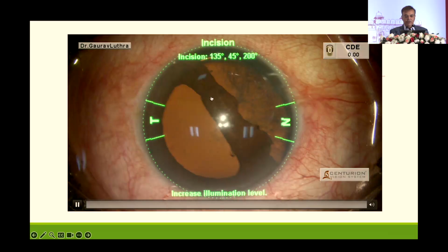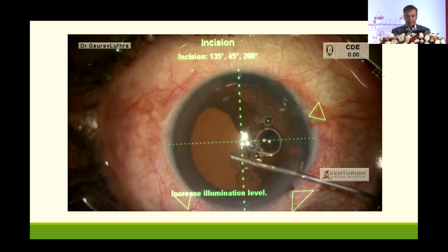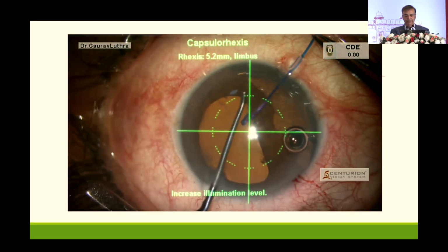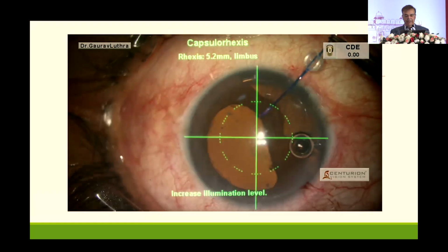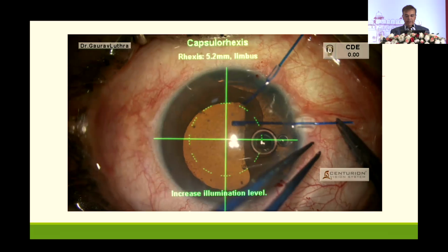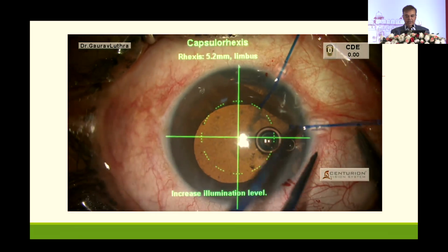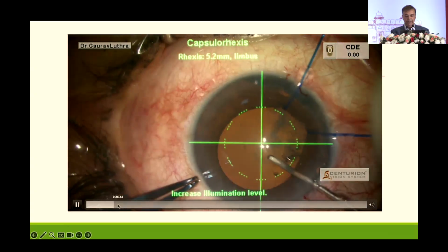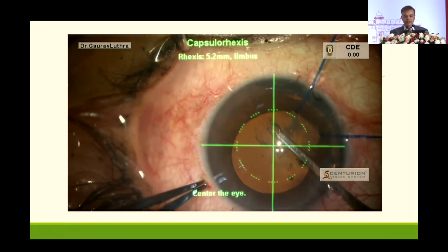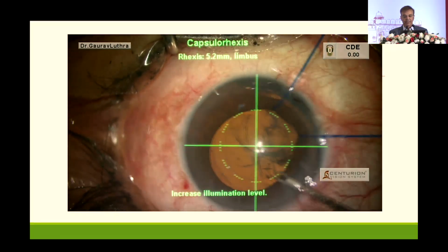This was another trauma, a firecracker injury. This lady had a big hyphema, eventually improved, but a big iridodialysis to repair. And we had to do the cataract, and there was a bit of a subluxation in that area as well. So you can get the iris to one side while doing the cataract surgery using the iris hooks. And this patient gave a history of having a pterygium surgery done. So the nasal conjunctiva where the big dialysis was a bit scarred.